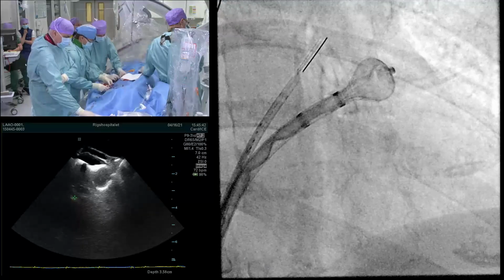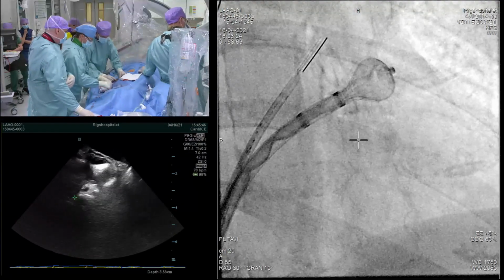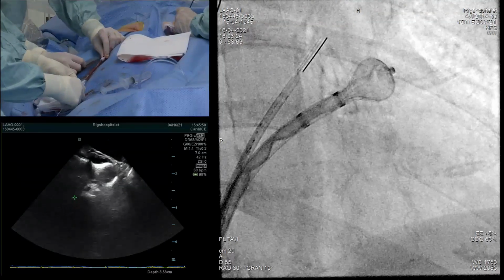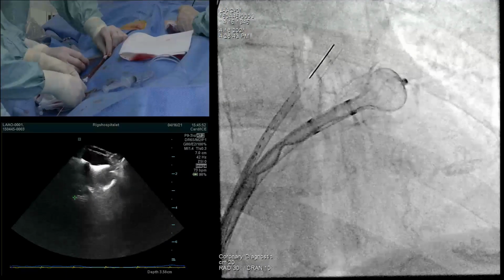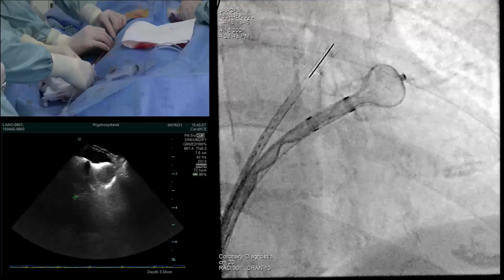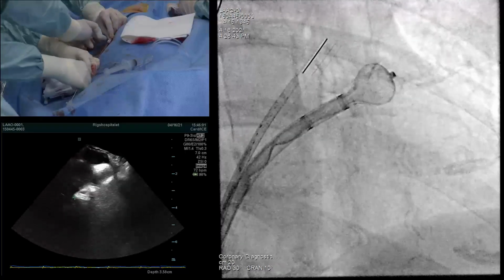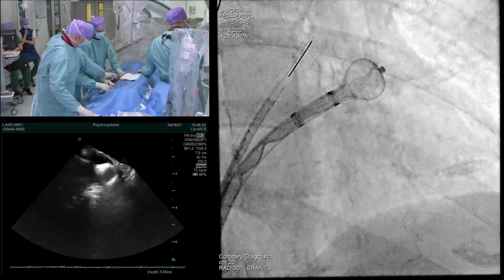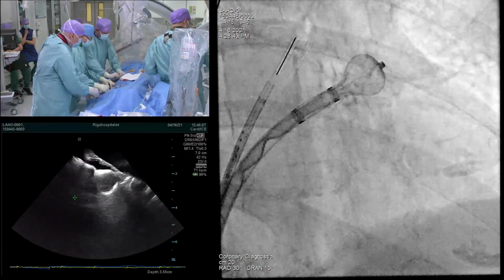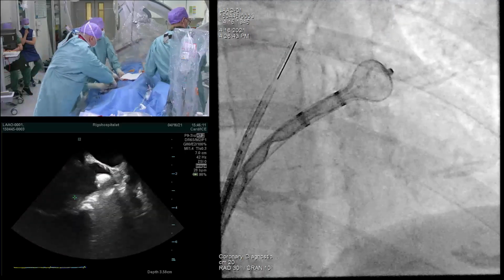Just one second. There's some air in. Okay, then it's better to retract it, I think. We have a little bit of air in here. So, of course, it's safer to pull it back. This is something you have to be very careful about. Otherwise, you open it here, Ole, and let it bleed back. Take that introducer tube out, let it bleed back, and this one will flush here.